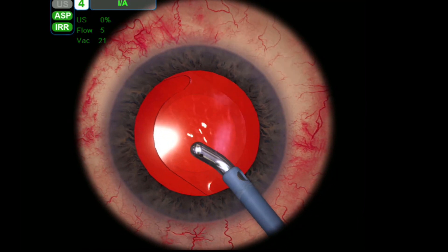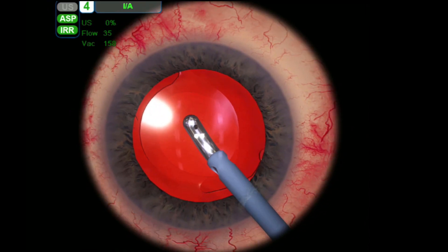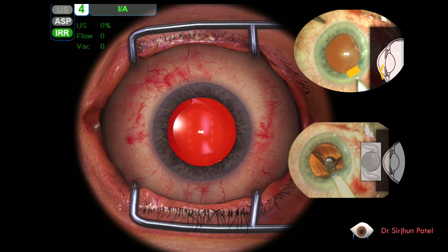Once we're happy with the lens position we put some antibiotics in the eye and that completes the operation. I hope you found this video helpful. You can check out my other video which is a real-life cataract operation which goes into more depth and detail about the procedure.